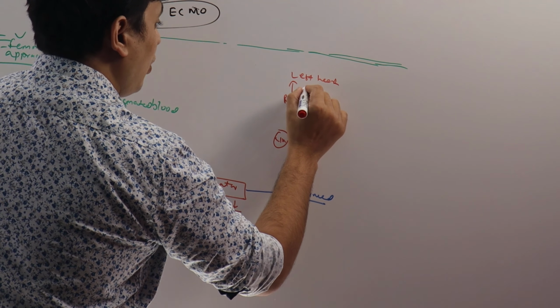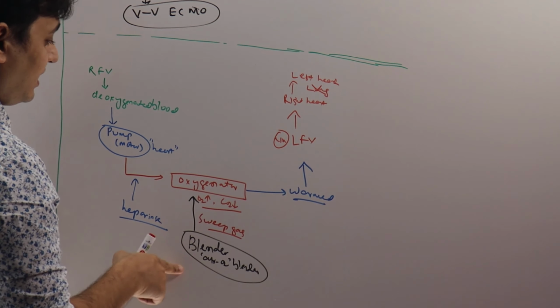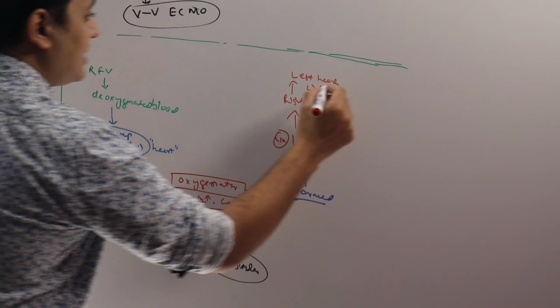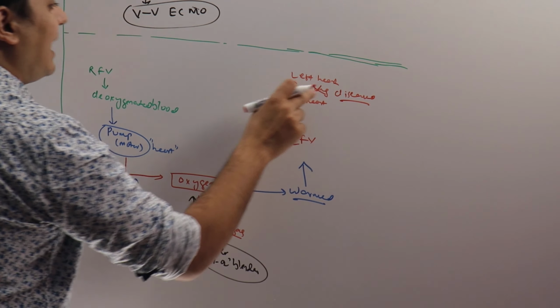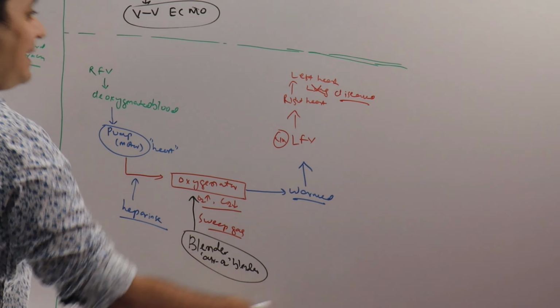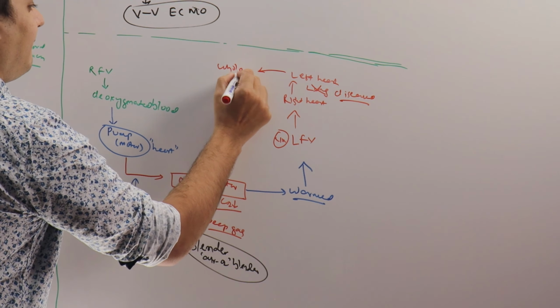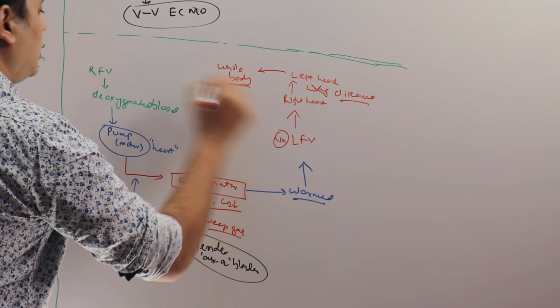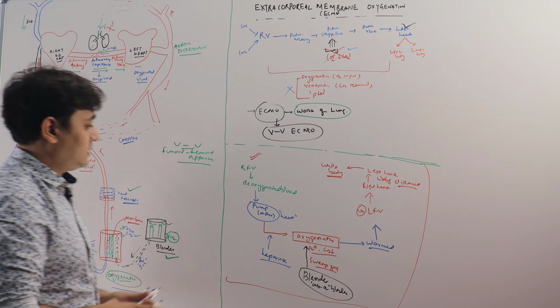And here the lung will not do any work, because the work has been done by the ECMO machine and the lung is diseased. So it will not work. So we will give time to the lung to recover. At the same time, we can utilize the oxygenated blood to be supplied to the whole body. Right. So this is how an ECMO circuit works.